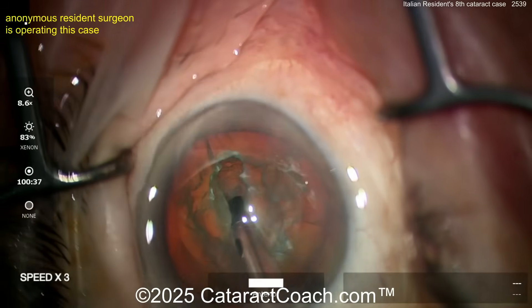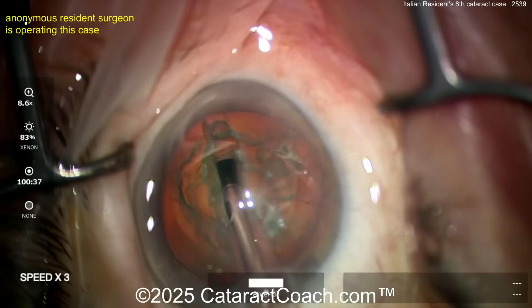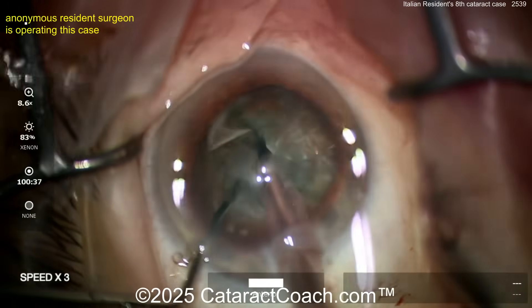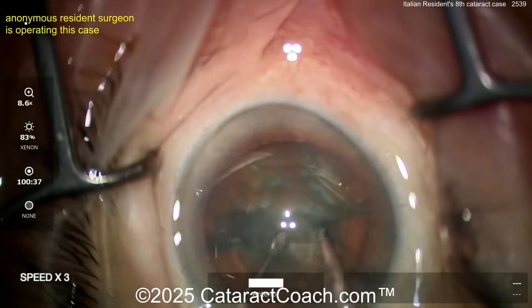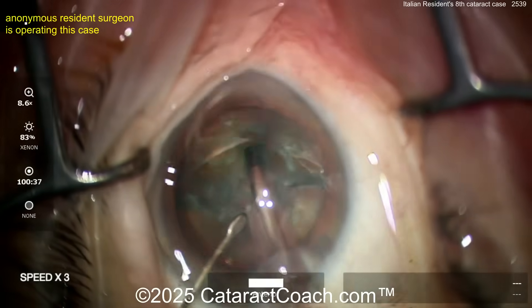Doing a groove down the middle — that's a pretty nice groove. Let's see if the eye is not quite centered. I can tell you you're early in the stage, but that's pretty good still. Groove down the middle, stop and chop — wow, look at that. This is amazing for case eight. And I believe it's case eight because people study a lot now. You're going to groove again — okay, so divide and conquer, not stop and chop.